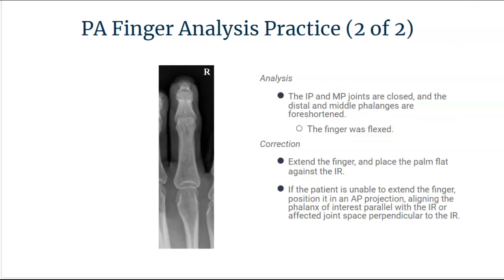In our second practice analysis, you can see that we have some distal phalanx foreshortening and some middle phalanx foreshortening. This is a result of the finger being flexed. What we need to do is extend that finger and place that palm flat against the IR to get a true PA finger projection.